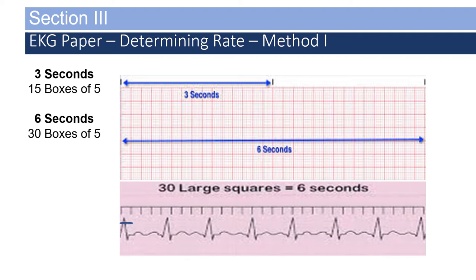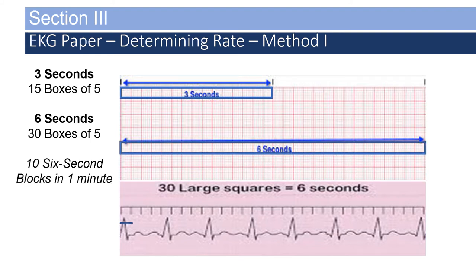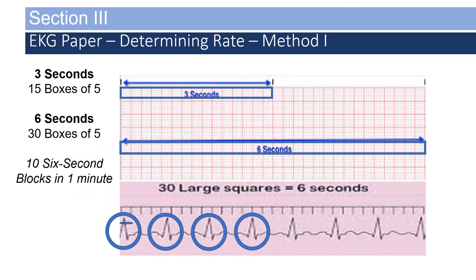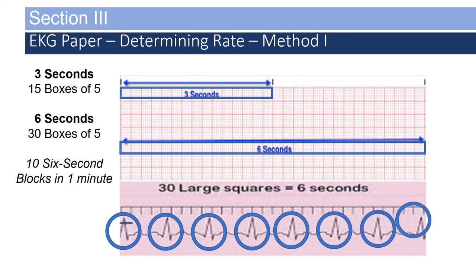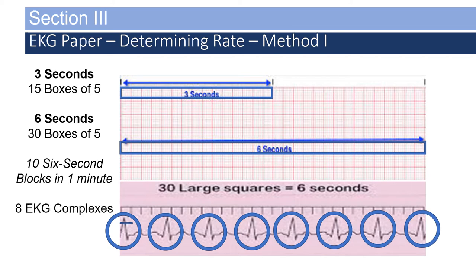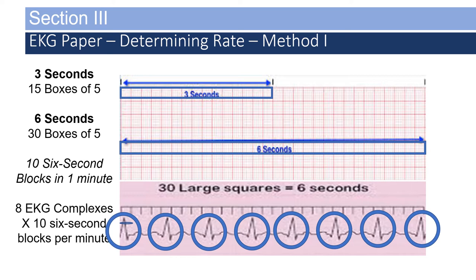There are 10 six-second blocks in one minute. If we count the complexes within six seconds, it looks like we have eight of them. Eight EKG complexes times 10 — because there are 10 six-second blocks per minute — gives you 80 beats per minute.